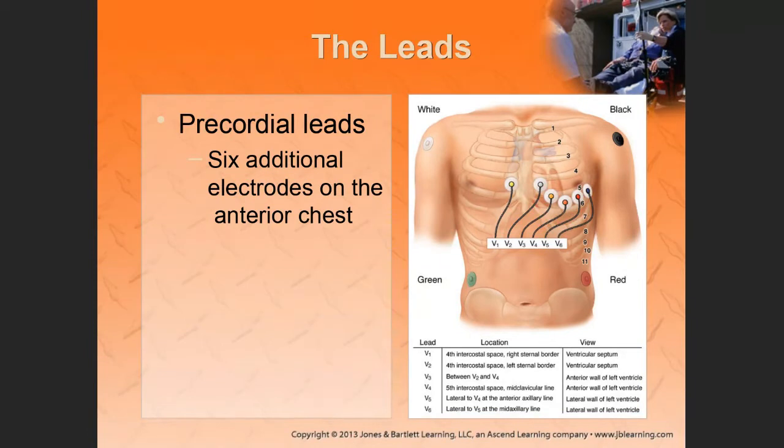Not electrodes, which leads, I should say. Which leads would look at the right side of the heart? It is clear as day.